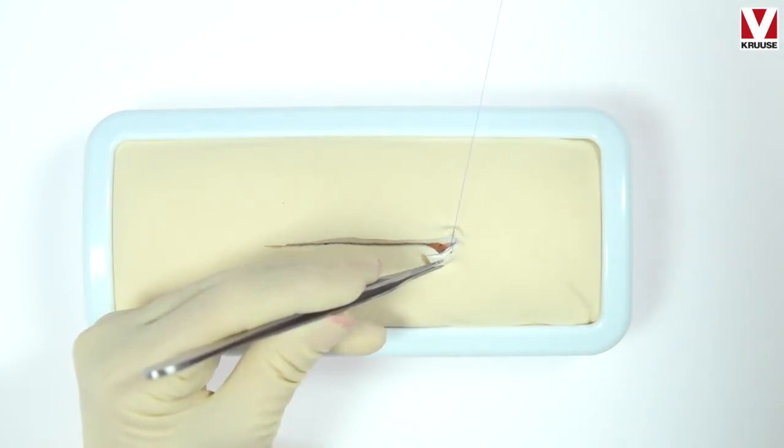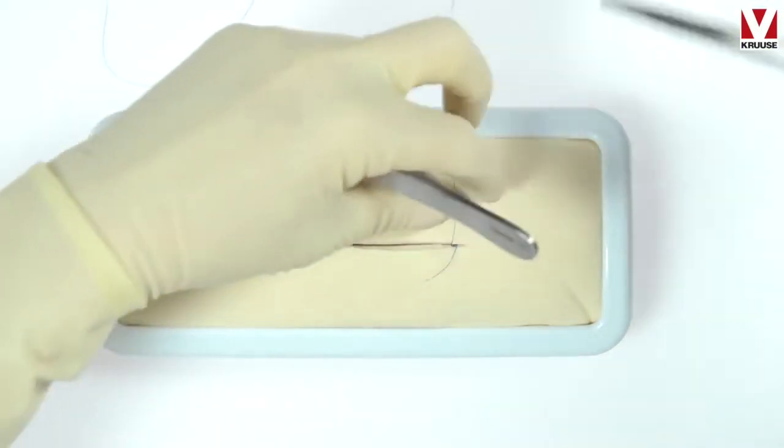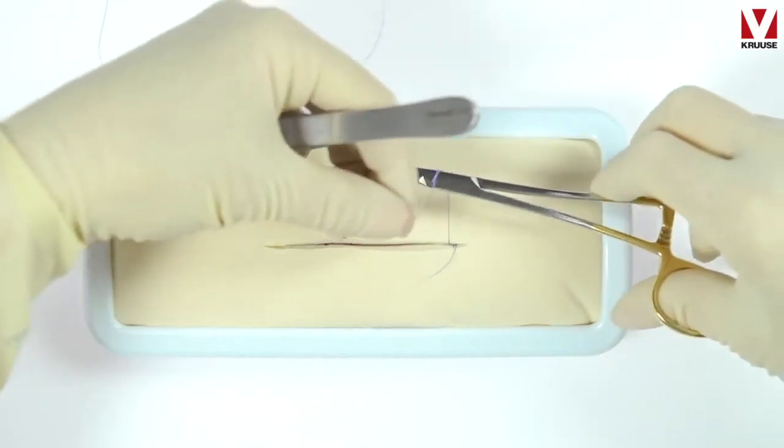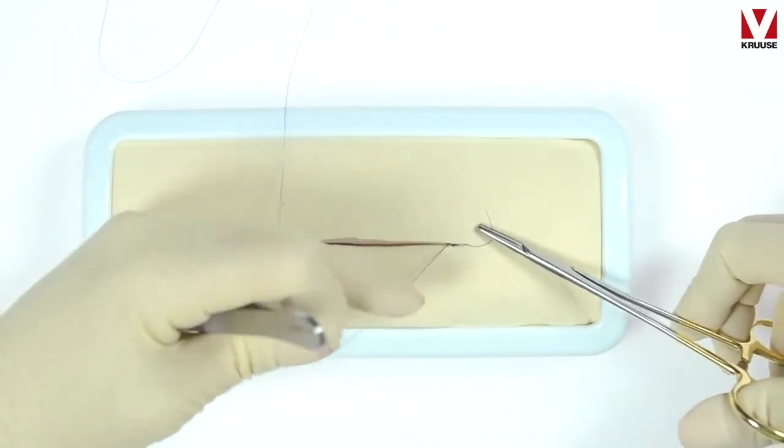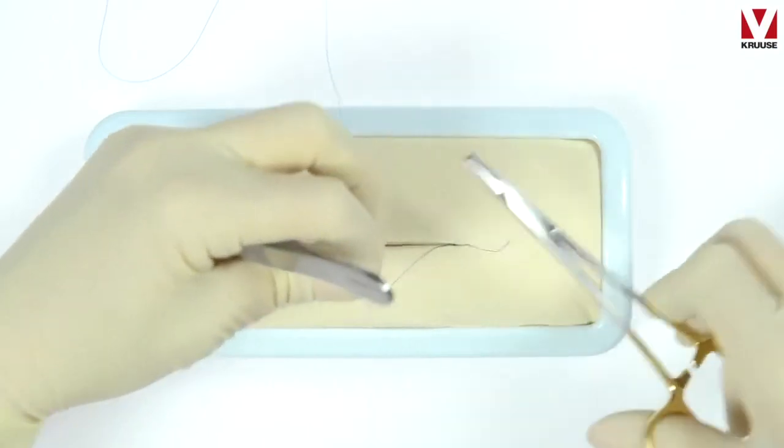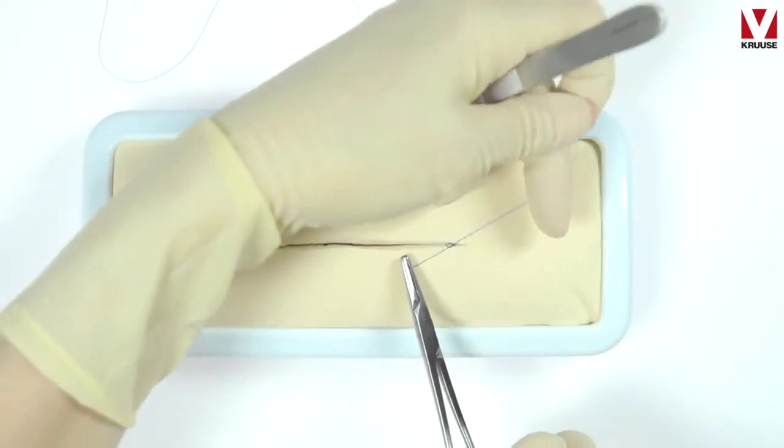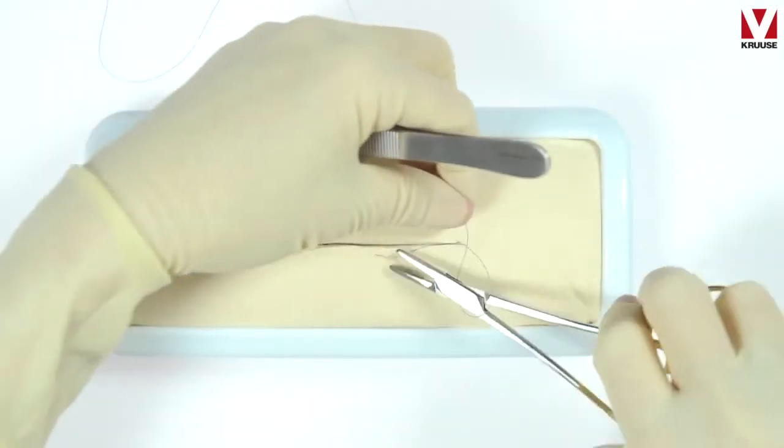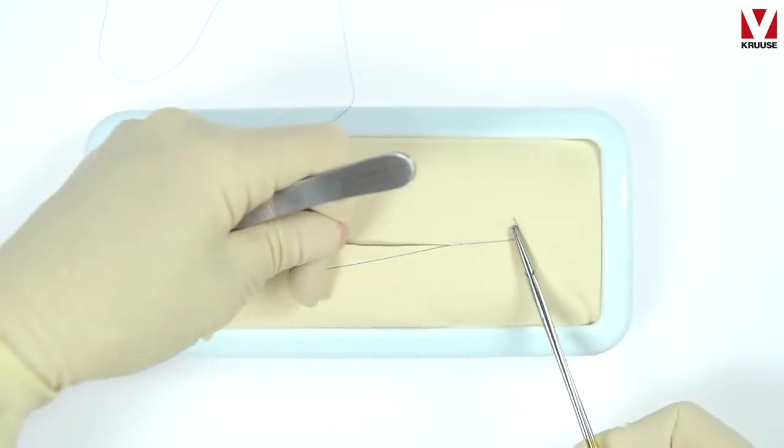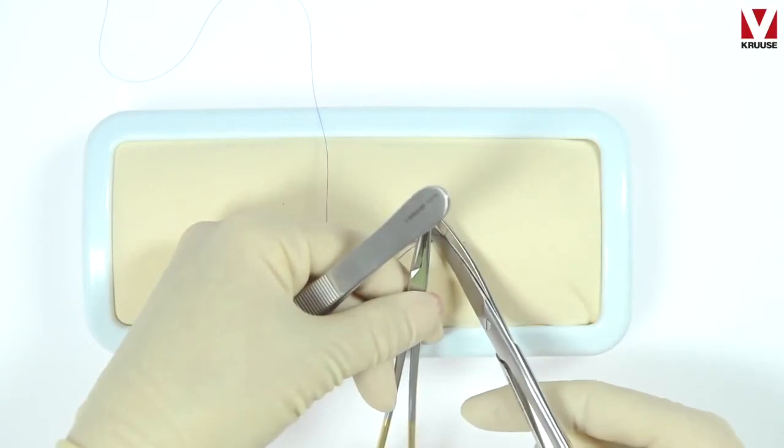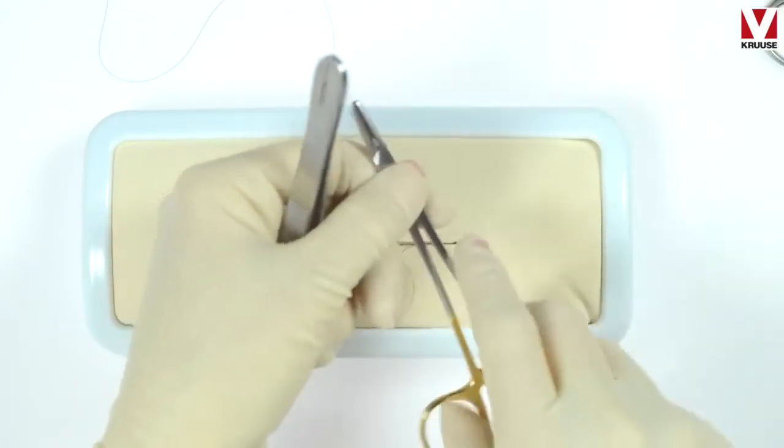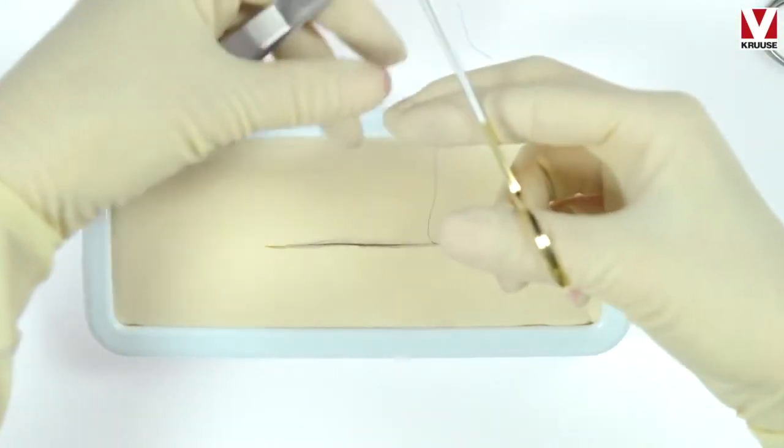Then I am ready to bury the knot. So you make a surgeon's knot, 2-1-1 or 2-1-1-1 if you like that. And then you cut the suture end close to the knot but not so close that it will slip.